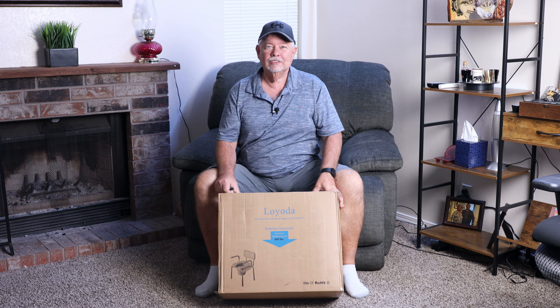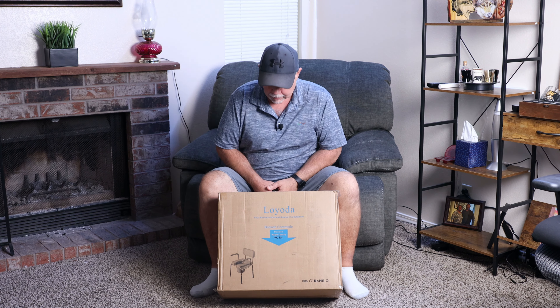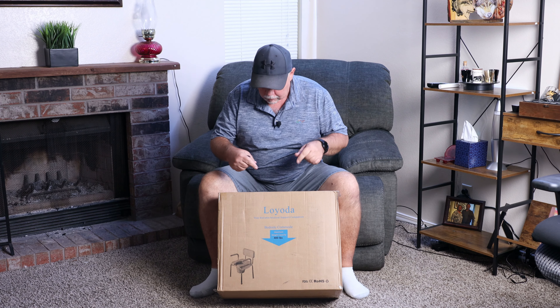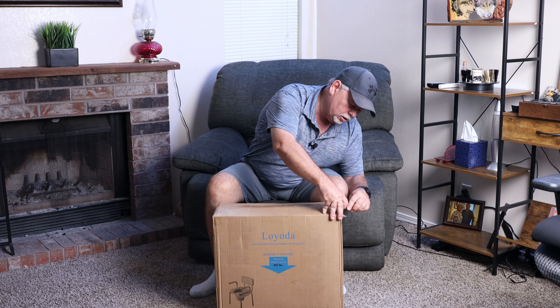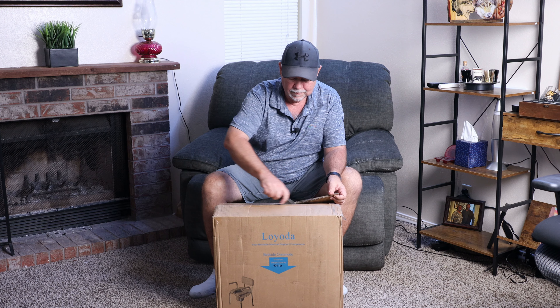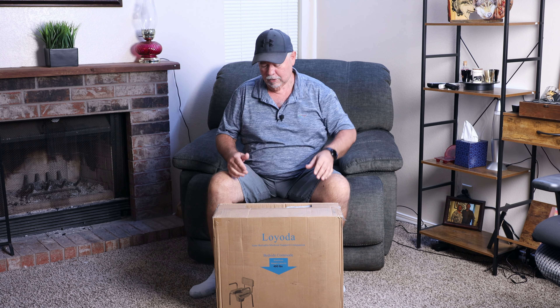Sometimes it's necessary to have a bedside commode, or what I would call a potty chair. The good folks over at Loyola sent this over for me to check out. So let's get it opened up and check it out. I've never had one, so we're going to learn how to put this thing together, see what it really looks like, and see how strong it is. It's supposed to have a 400-pound weight capacity, so that's a pretty stout chair.